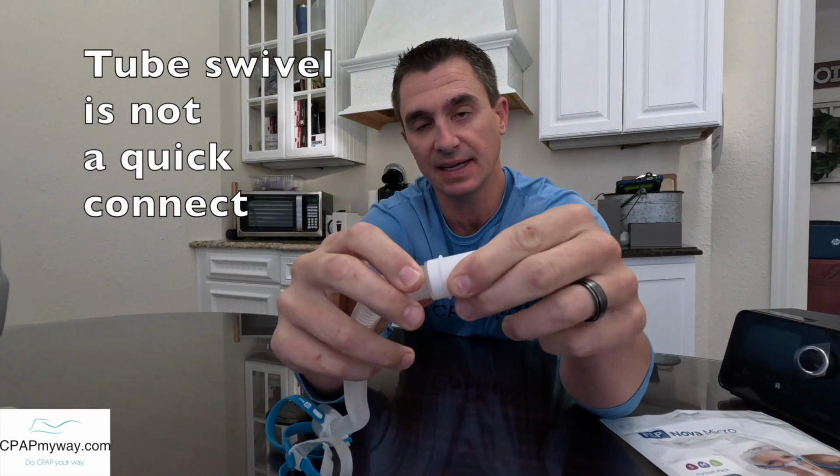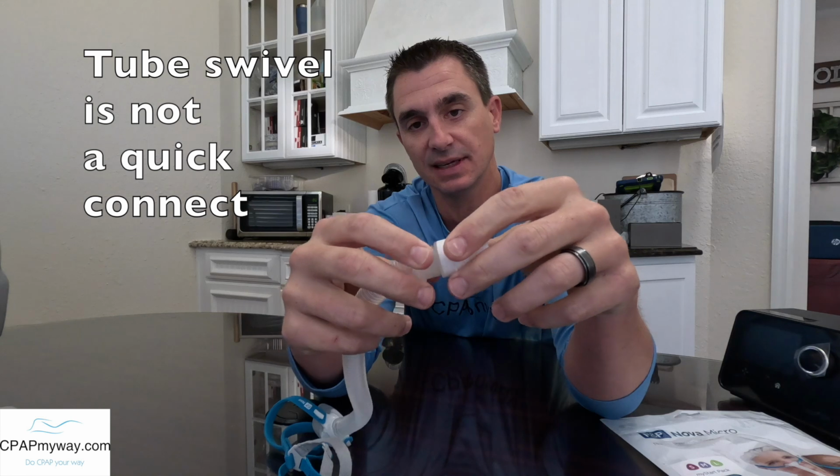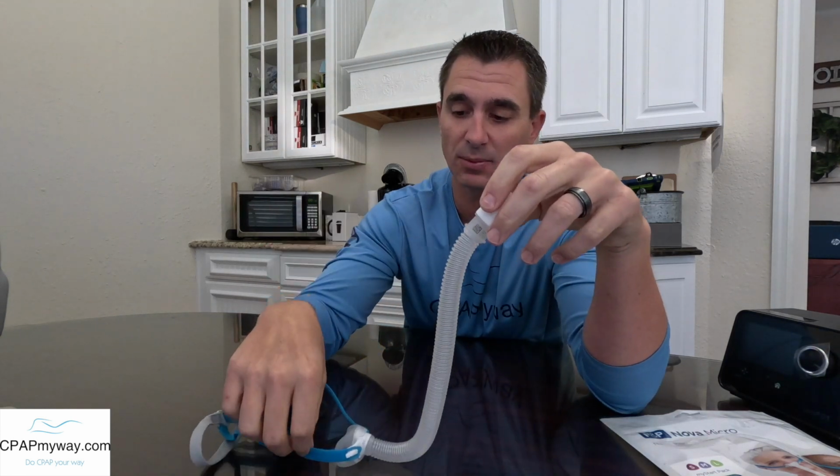The other thing I just want to show you real quick is that this is not a quick disconnect. A lot of those masks have a little quick disconnect here. You've probably heard me in previous videos saying that I think they're worthless. They are. Most people with a nasal pillow mask like this are just going to refit. You know, you're going to take the mask off, get up, do what you need to do, drink a glass of water, go to the restroom, come back and put the mask back on, because it takes 2 seconds to fit it.